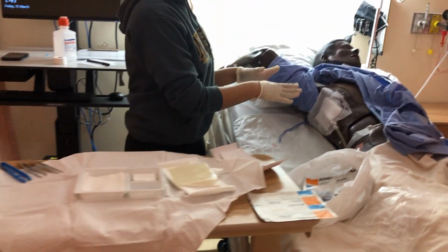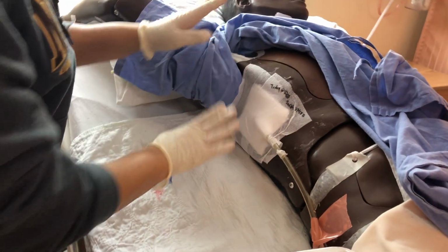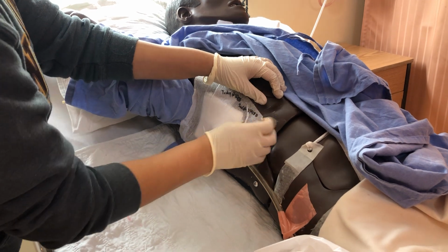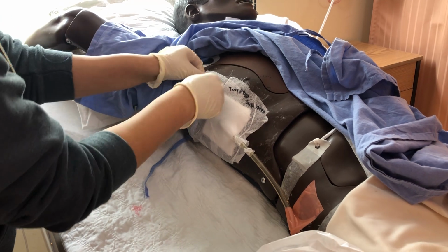Now I'm gonna check the patient's side for subcutaneous emphysema. So just palpating, and there's no crackling sensation, so I know that's not happening. So I'm going to now remove the dressing. Here, okay, and that's going to be garbage. So now I'm assessing the site and the redness.